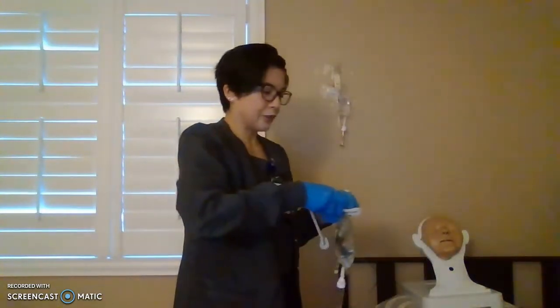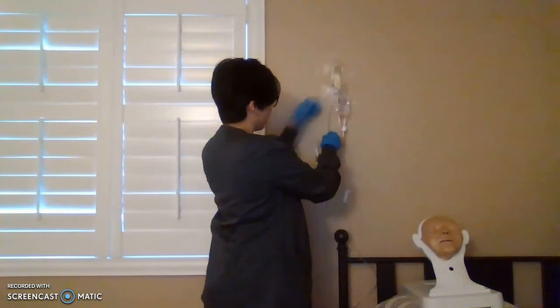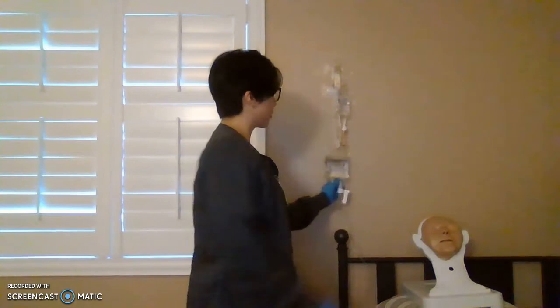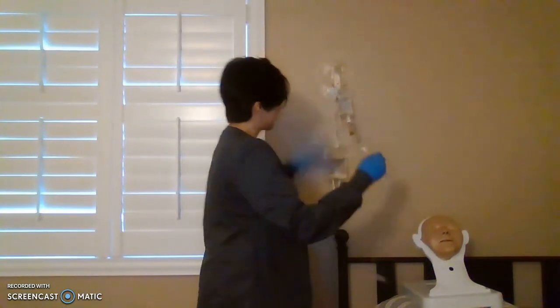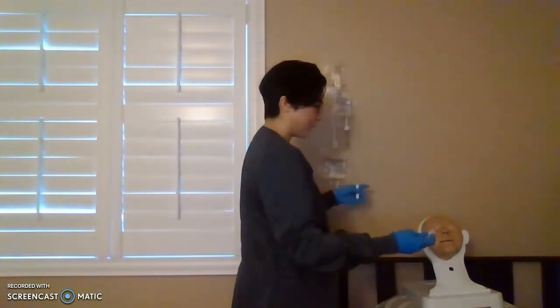This is still closed. We're going to lower down your primary fluid. Why? Law of gravity. The higher one gets pulled going to your patient first because we want that to run. After that runs, your primary fluid finishes off. So right now, this one is higher, your antibiotic, which we need to infuse to your patient. But first, we are priming.